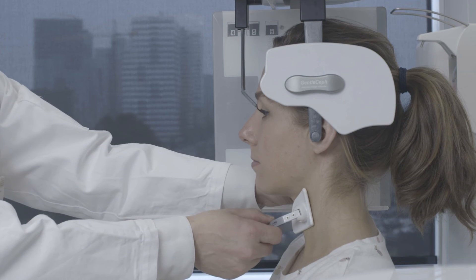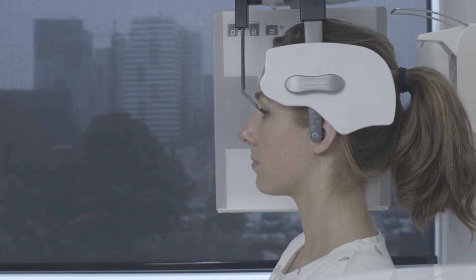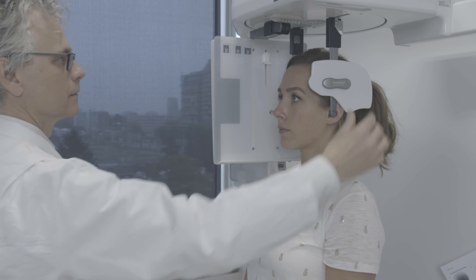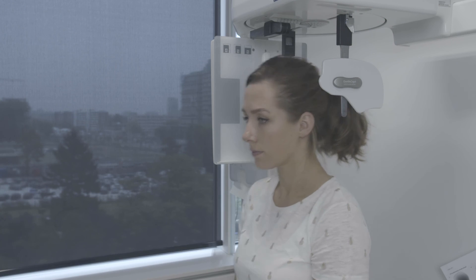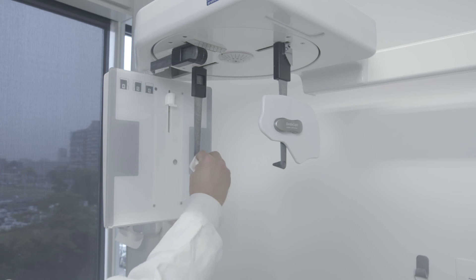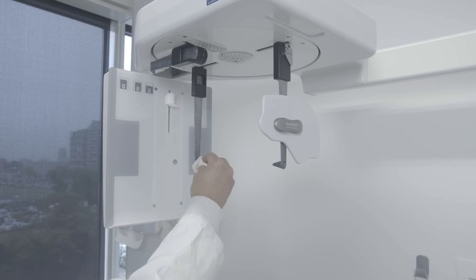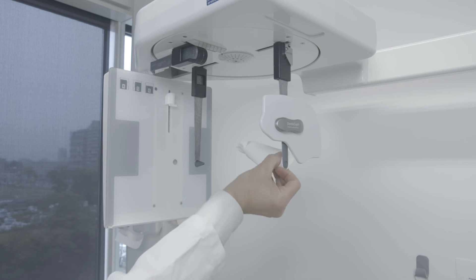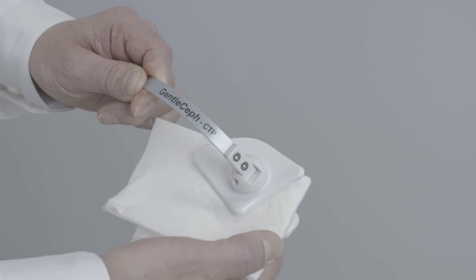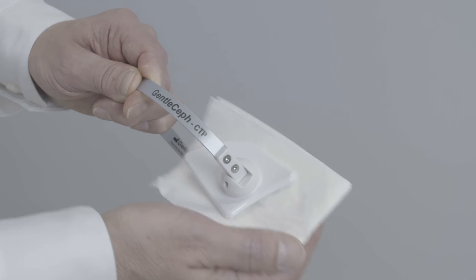After the exposure the thyroid protector can be removed and the patient can be let out of the cephalostat. As usual the x-ray machine is cleaned with surface disinfectants. The thyroid protector is also treated with a surface disinfectant before it is used for the next patient.